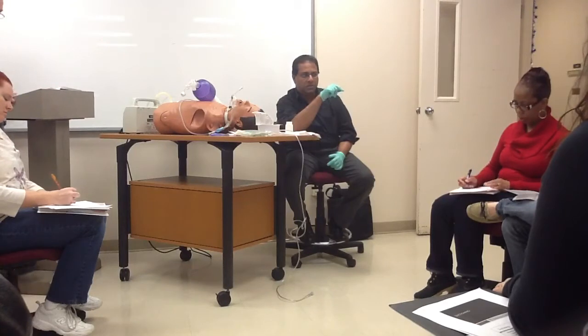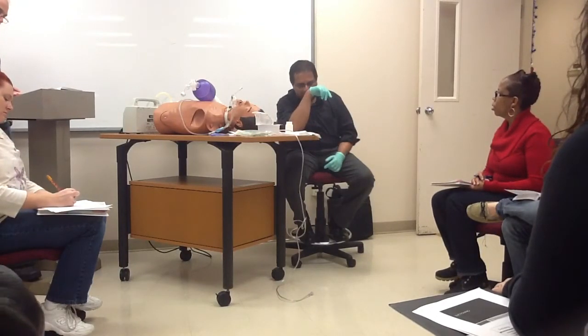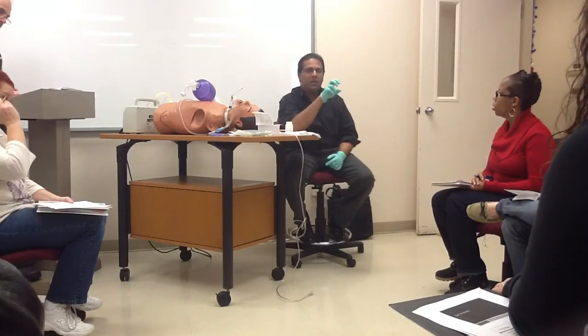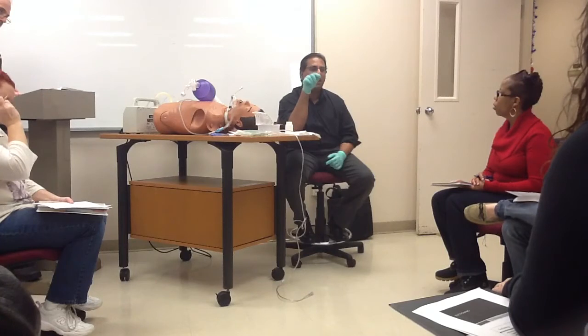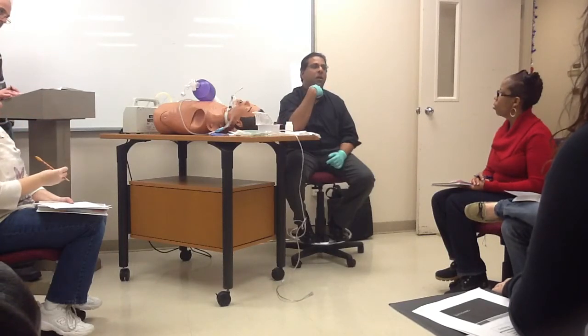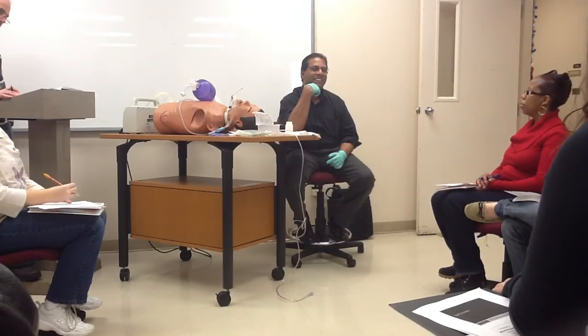Which one are you going to use, a 10 or 12? I want to make sure it's going to fit. A larger one is going to suck more. Yeah, the larger one will suck more. The problem is it's going to block the airway. So is a 10 better, if you have an 11?